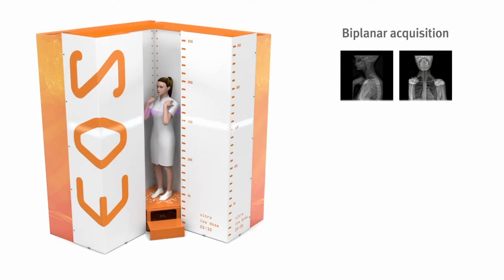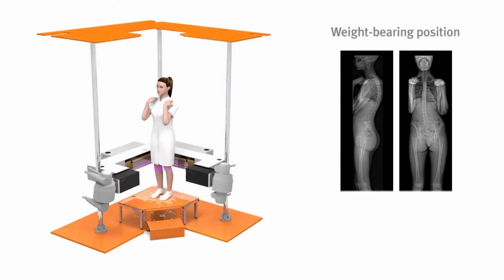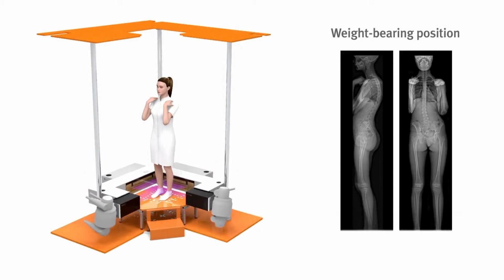Don't be shocked initially by the sticker price. Clearly, it's expensive technology related to a simple plain x-ray, but it's better than a simple plain x-ray. And the improvement in your practice in terms of efficiency, of safety to your patients in terms of radiation, the ability to truly monitor what you think you're doing and make sure you're actually doing it post-operatively with x-rays really is going to make your practice better, it's going to be better for patients, and ultimately the price that you pay for the machine is a small fraction of the value you're getting.